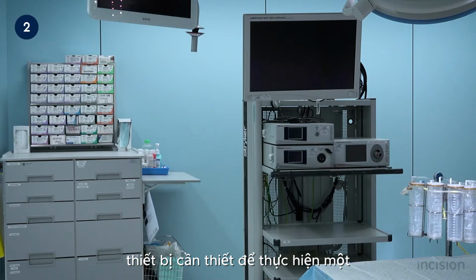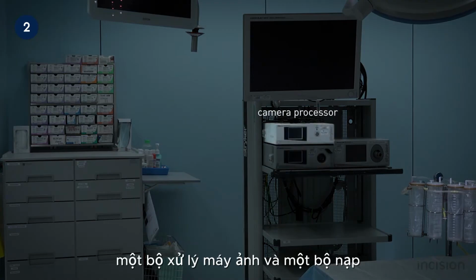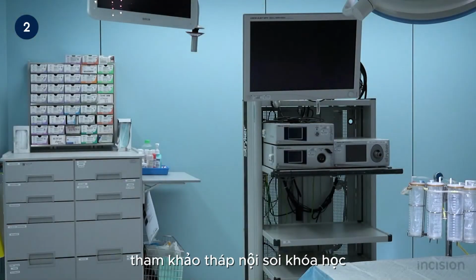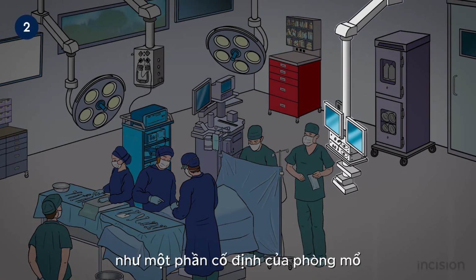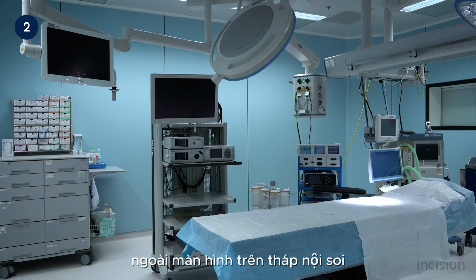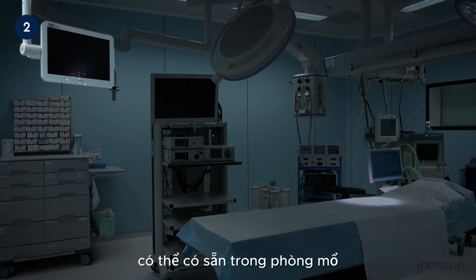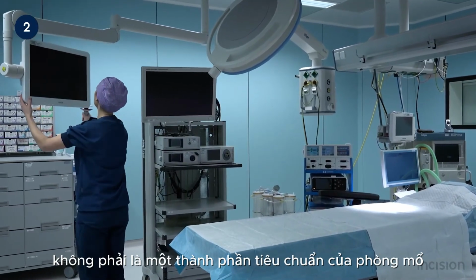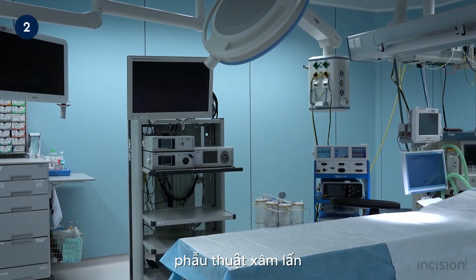Devices which are needed in order to perform an endoscopic procedure are a light source, a camera processor, and an insufflator. For a more detailed elaboration of this, refer to the course Endoscopy Tower. The components are located either on a built-in column as a fixed part of the operating room or on a separate mobile tower. Besides the monitor on the endoscopy tower, additional fixed monitors might be available in the operating room and can be placed in different positions. Take note that the endoscopy tower is not a standard component of the operating room, but widely used since the introduction of minimal invasive surgery.